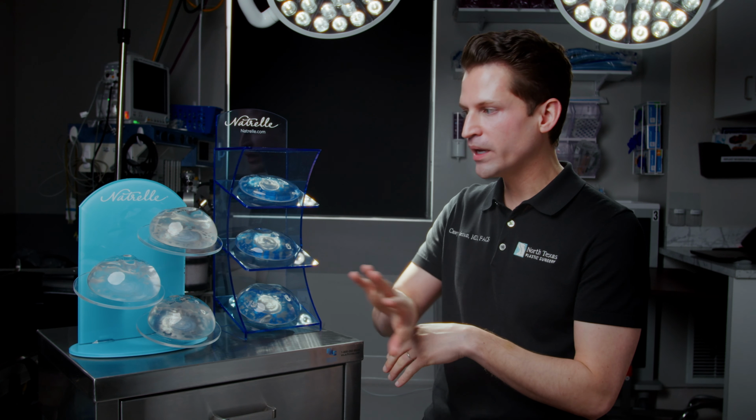I know that we have so many options and varieties, and every patient who comes in wants different looks, so they should be able to get what they want. I shouldn't be some dictator on high that tells you what to get. You should tell me what you're looking for, and I can help guide you there. So when somebody asks, what profile should I get? That's maybe not the most ideal question. The question becomes, what look are you going for? And then we can tailor everything to you.